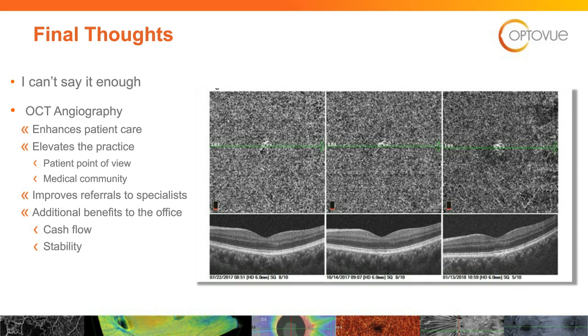Okay. Personally, I find OCTA to be well suited for retinal disease, diabetic retinopathy, retinal vein occlusion, and somewhat less so for the choroid, AMD, central serous. How meaningful have you found results in testing and in determining whether your patient may ultimately be treated for CNV? I think tonight, hopefully that answered your question. I've answered that. This is where I have become a kid in a candy store.